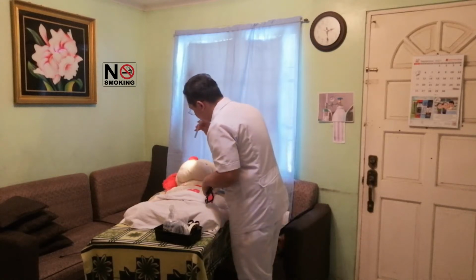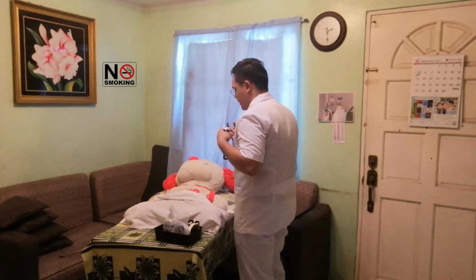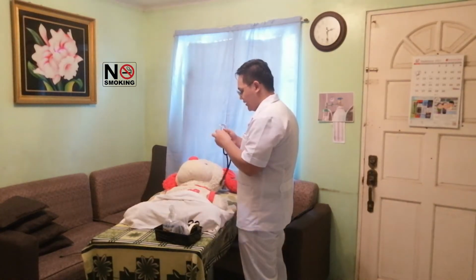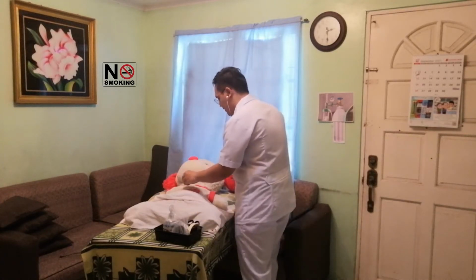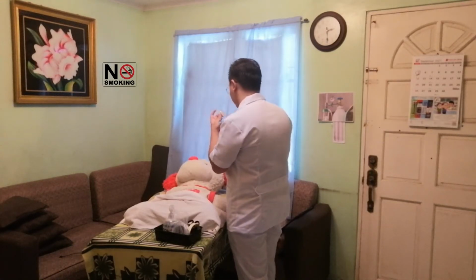Okay. Okay, thank you po. And now ask ko lang po kayo to take a deep breath. Okay. So deep breath po. Ready? 3, 2, 1. Okay. Thank you po.